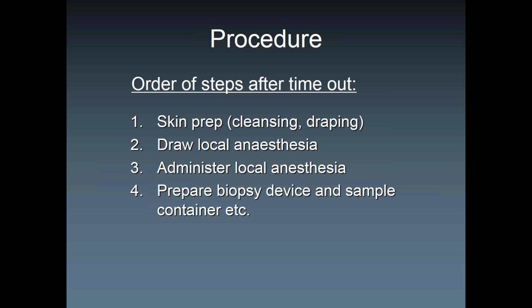So step number one should be just prep the skin, clean the skin, because time also works in the patient's favor. So while, let's say, the ChloraPrep is kind of air drying, it acts, right? So it kills bugs. That time you don't need to wait, you just do other things. So in the meantime, you draw the local anesthetic.